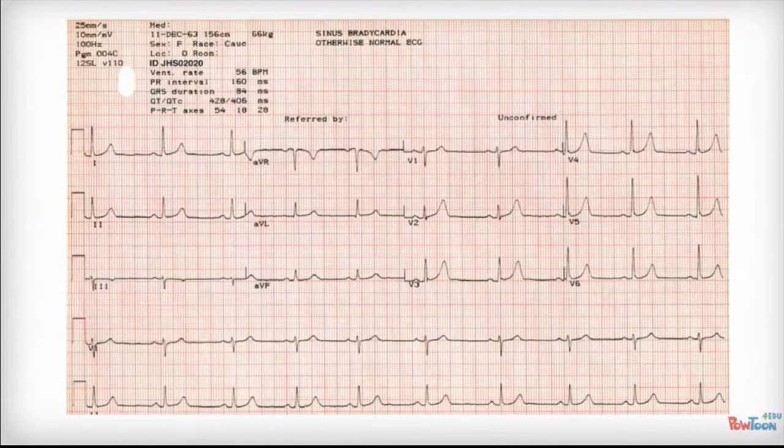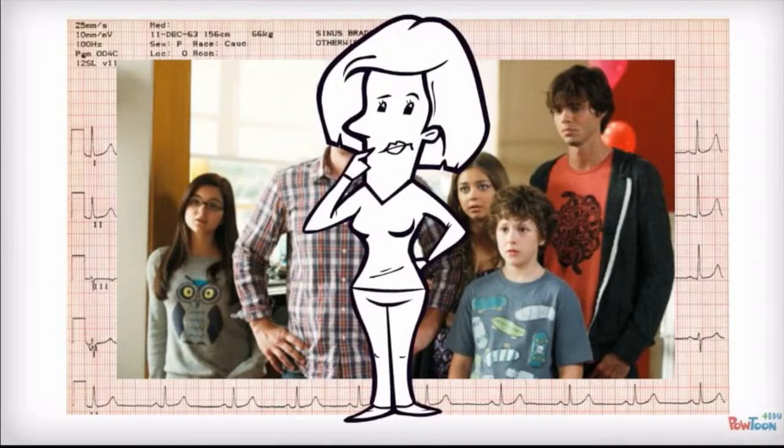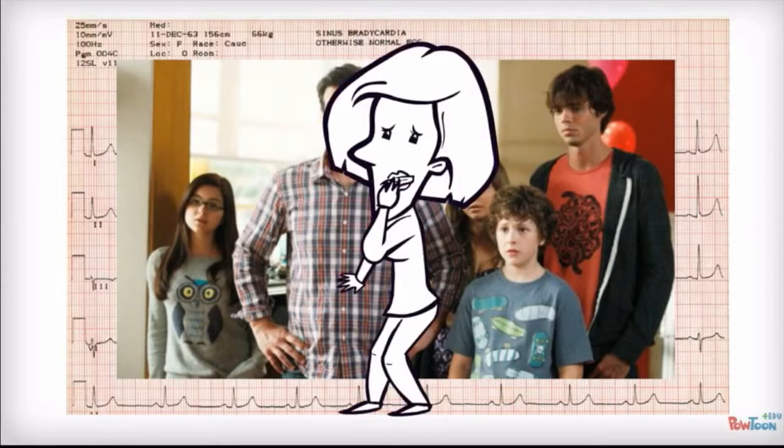Frequently this is a stressful situation because there's a family clearly worried about their child and they want us to make the right decision. So we go from being thoughtful and systematic to being worried and scared that we're going to make the wrong decision. But after this lesson, we will have learned a systematic 4-step approach to interpreting an EKG.